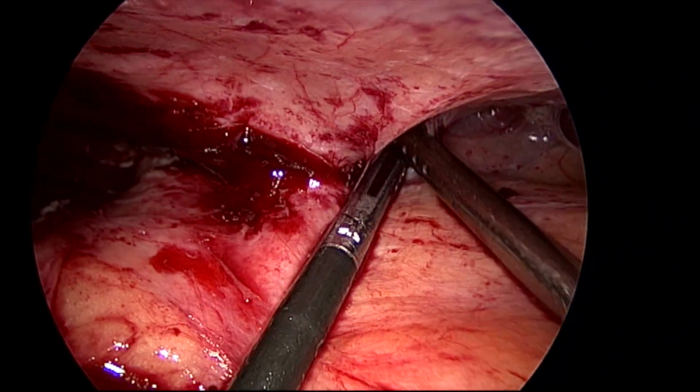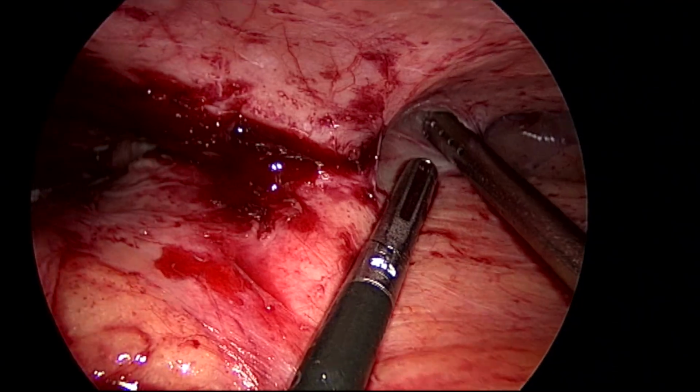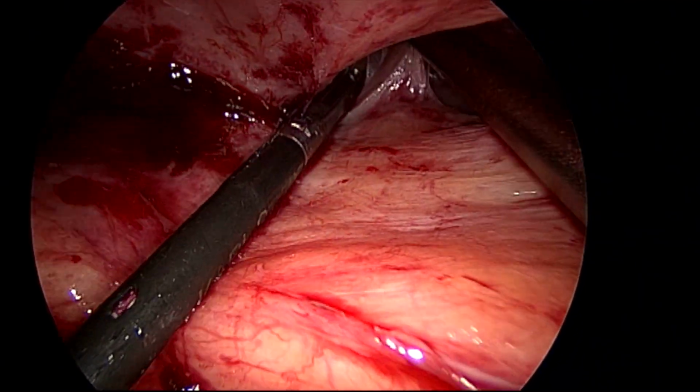So now I can see the liver surface, the inferior surface of the right lobe of liver. I'm going from there.